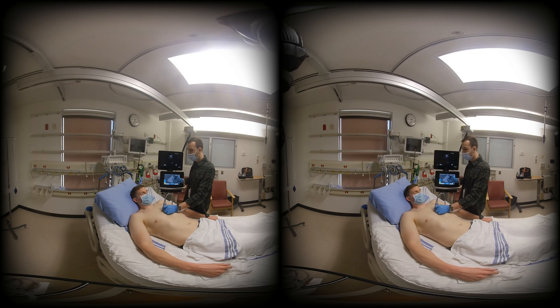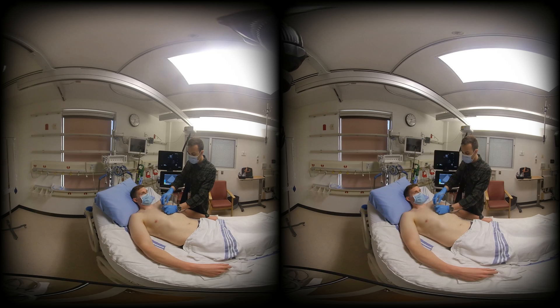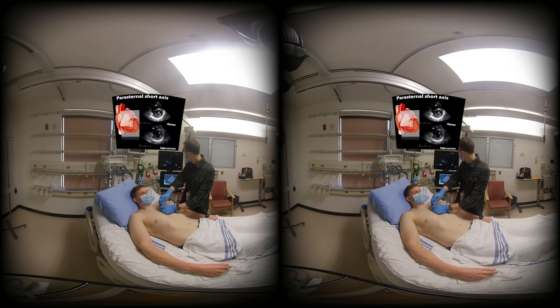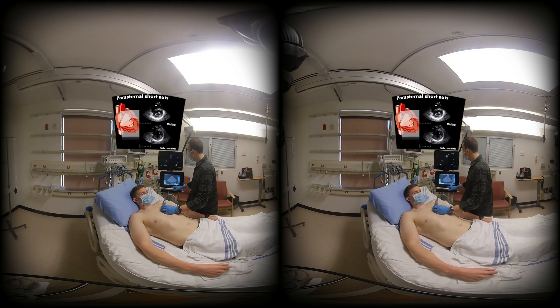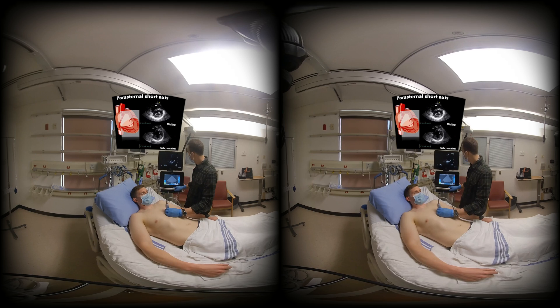Once I've assessed these things in the parasternal long axis view, I'm going to rotate my transducer by 90 degrees to cut through the left ventricle on short axis. I'm going to use my left hand to keep the transducer oriented over the heart and my right hand to rotate it so that the probe marker is now facing towards his left shoulder. Once I've got the basic alignment, I'm going to optimize the image on the screen. What I want to see is the left ventricle shaped like a ring with the two papillary muscles visible at the same time. I'm sliding the transducer towards and away from the sternum and rocking the probe to get a good window. Things are a little dark, so I'm just going to increase the gain on the screen a bit.